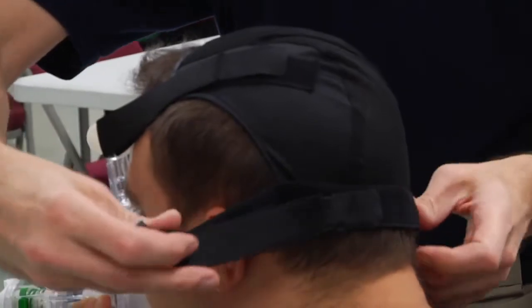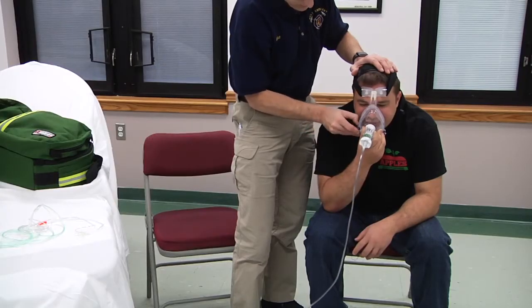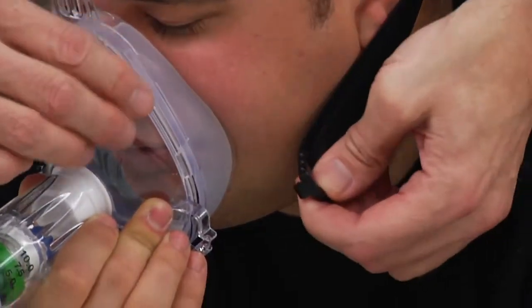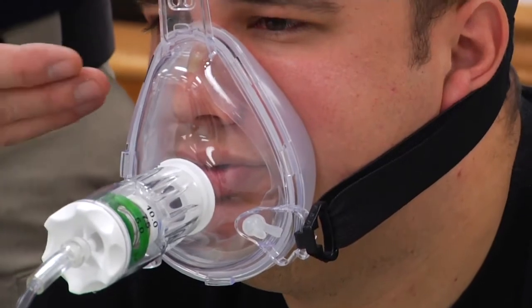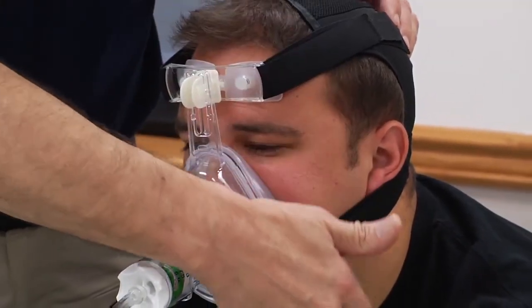This is somewhat tricky. These things come packaged in a very loose fashion, and ultimately you want this to be able to hold the mask on the patient so that they can breathe adequately and have a seal where you're not feeling gas escaping from any of the parts around the mask. Now the mask has a vent where you are going to feel gas escaping from the mask because you don't want to asphyxiate the patient should the gas suddenly stop flowing for some reason or another.